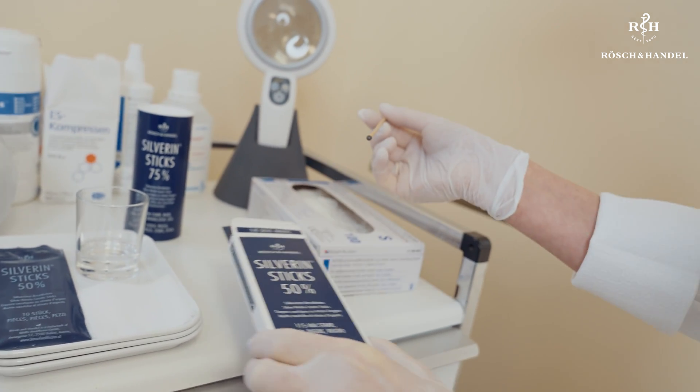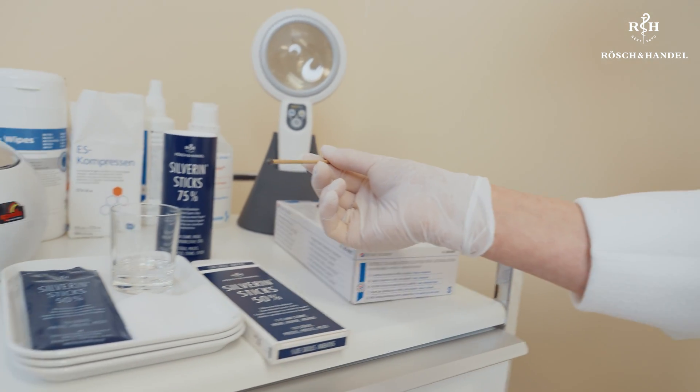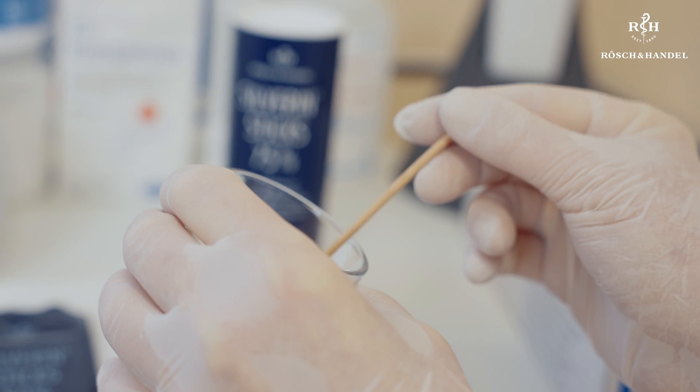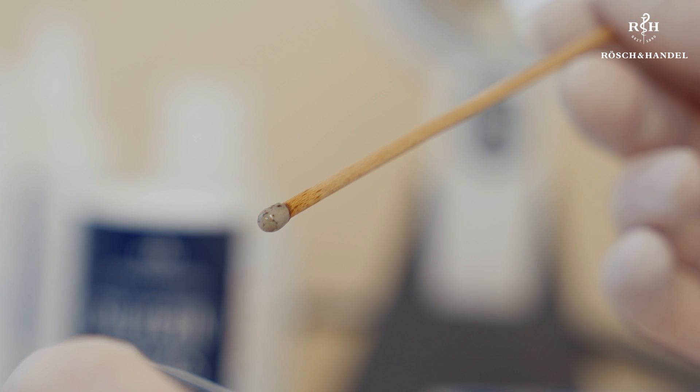When treating patients with silver nitrate applicators, here are some key things to bear in mind. I begin treatment and show the patient how it works. It's important to briefly dip the head of the applicator in a glass of water, or hold it briefly under a running tap — it only needs to be moist.